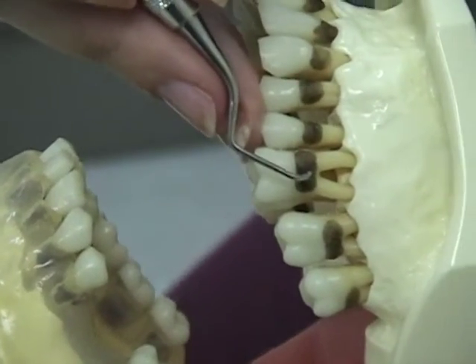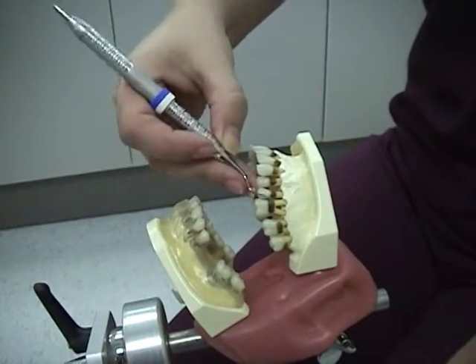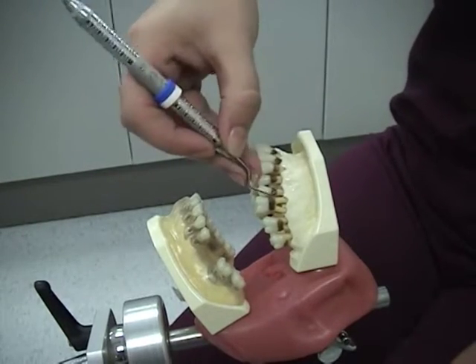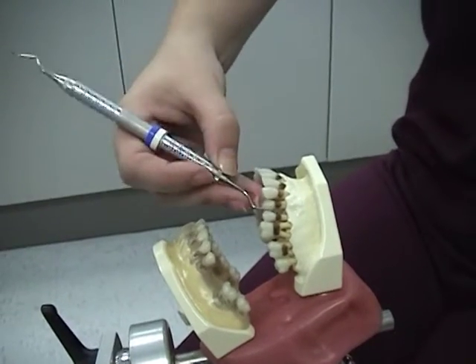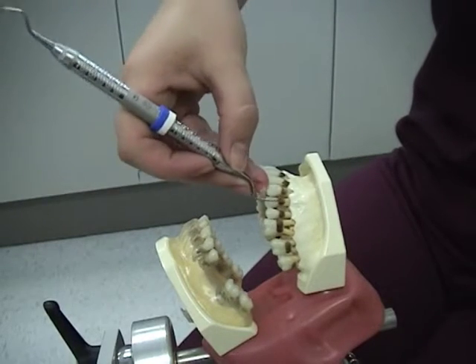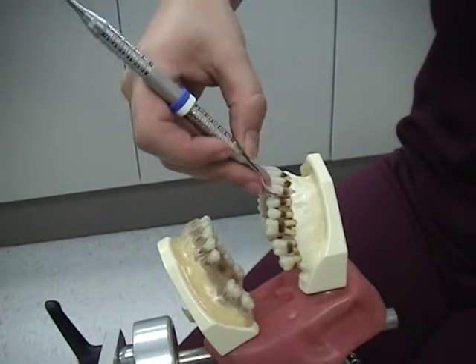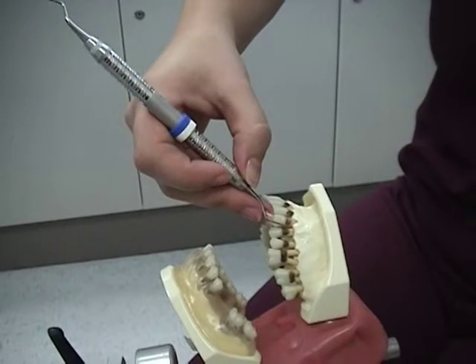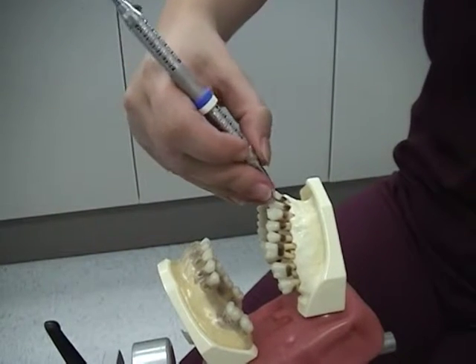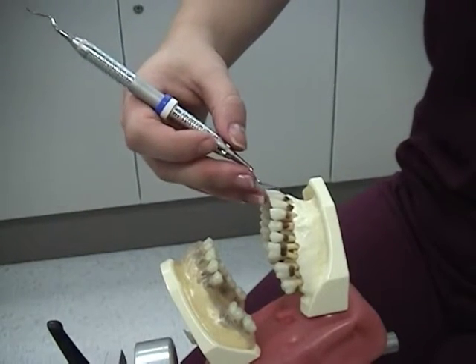Wrist motion, or wrist rock: you will be rotating your hand and wrist as a unit to provide the power for the stroke. Watch as the clinician establishes the fulcrum and then rotates the hand and wrist as she moves the instrument across the tooth. Digital motion is not recommended for any instrument other than the periodontal probe — if you use digital motion, you will not have the necessary strength to remove deposits. The fulcrum position is often incorrect when this happens, causing finger flex rather than wrist rock. Notice the difference between wrist rock and digital motion; repositioning the fulcrum corrects that.